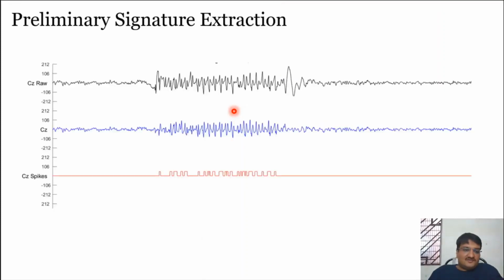So what I am trying to say is, this is one of the actual human EEG samples recorded. Further, it should be pre-processed. This is a raw signal recorded in a Nicolet EEG system. It should be pre-processed. Why? Because a normal recorded human EEG will have so many artifacts. So what is an artifact or noise? Anything apart from your biopotential coming out of your head. In other words, anything except information is your noise.